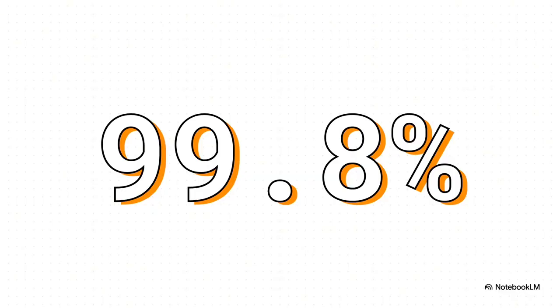But here is a wild fact about all this. The whole process is, believe it or not, unbelievably inefficient. A staggering 99.8% of all that energy is just lost as heat. That means less than 0.2%, not even 1%, of the energy actually becomes the X-rays that make the image. All that work for such a tiny result?